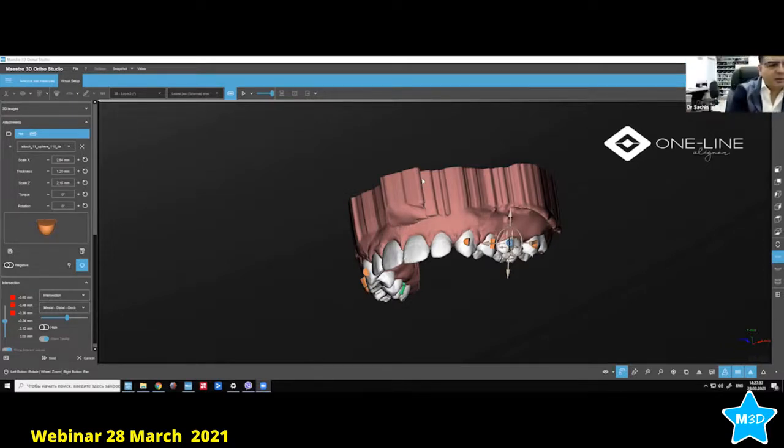Do you use the attachment on the lingual palatal side? Yes, we do use it. Can you show extrusion of the upper lateral incisor? Extrusion of the upper lateral incisor is a very, very big question. Everybody wants to know what we can do, especially for lateral incisors. I was talking with Dr. Nicozes, who developed a sash attachment. There are a couple of those yin-yang attachments, the sash attachment by Dr. Jonathan Nicozes from New York. Then we have the new Invisalign attachment which has come up. It's a horizontal optimized attachment for extrusion. I'll just show you what I use for it.